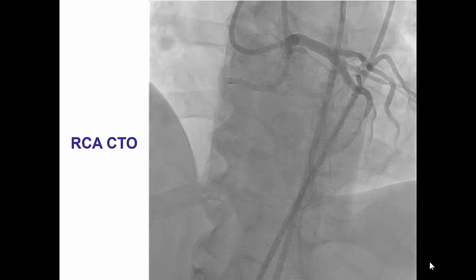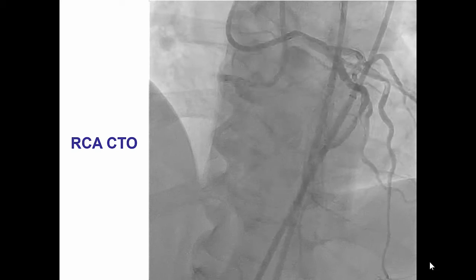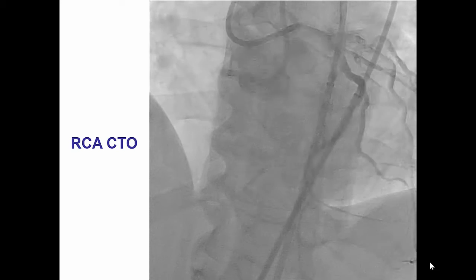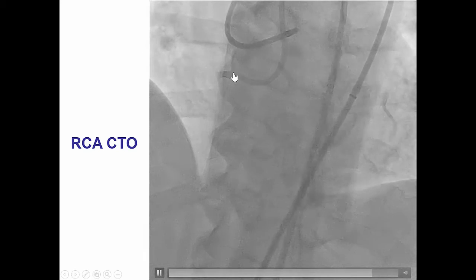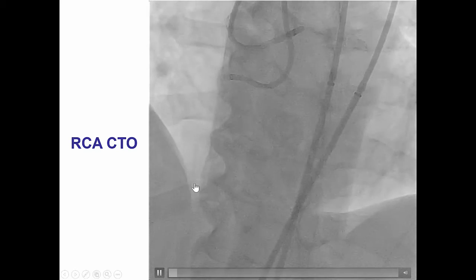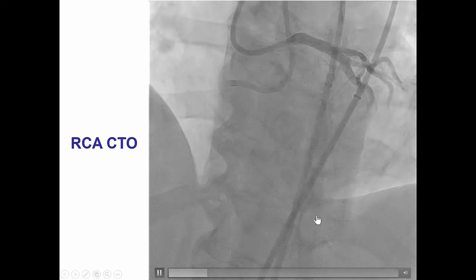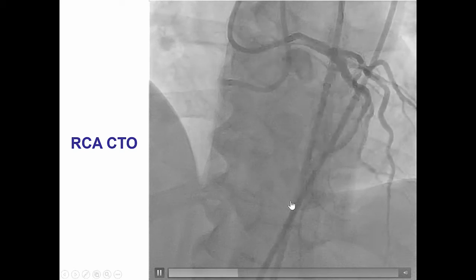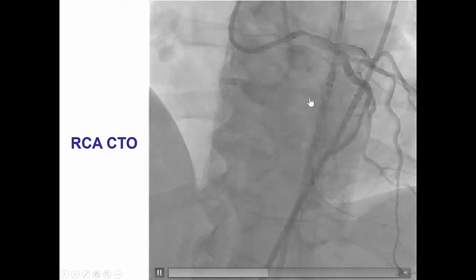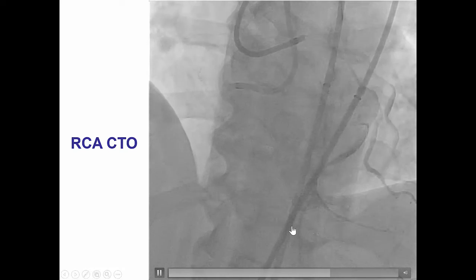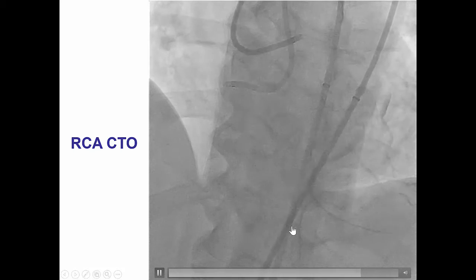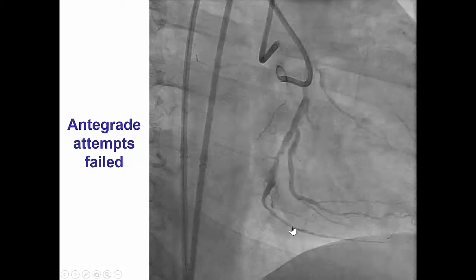The patient had a right coronary artery CTO that was ostial with a very long occlusion length, and the distal vessel was filling via both septal and epicardial collaterals from the LAD and the circumflex.